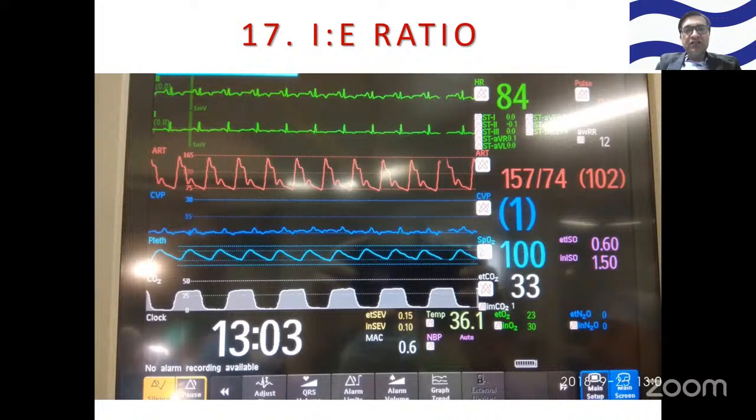What could be the IE ratio of this patient? 1:2, 1:2, 1:2. Okay. 1:1.5. Good. Great. New answer.